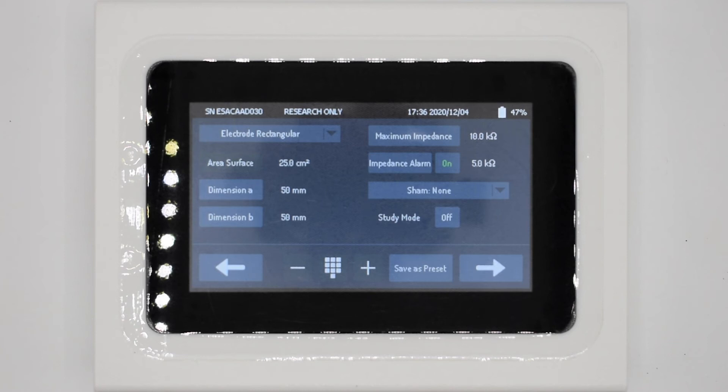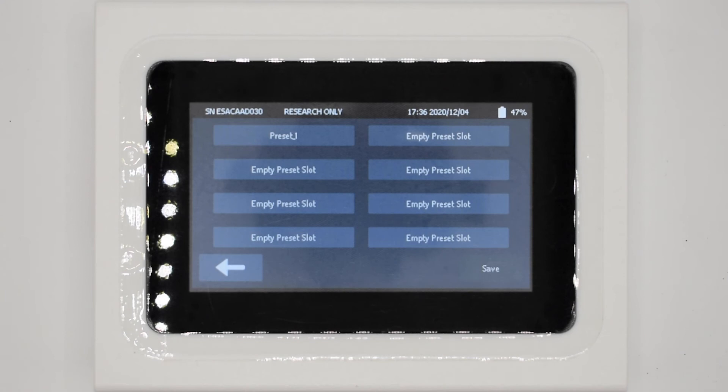At the very bottom of the screen is the option to save all of this data as a preset. This means the next time we deliver this protocol we can set it up much faster.